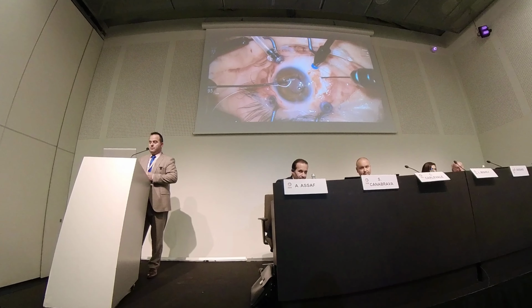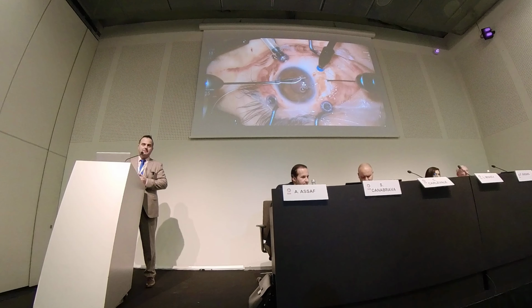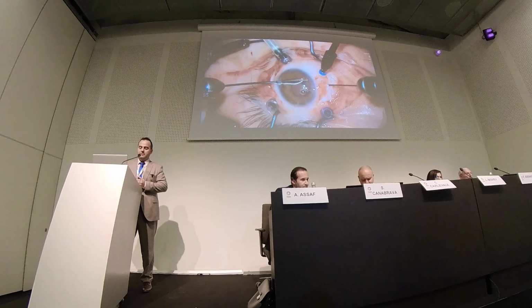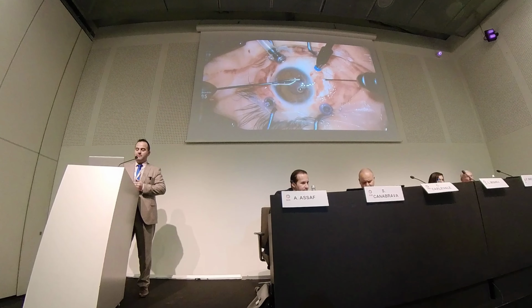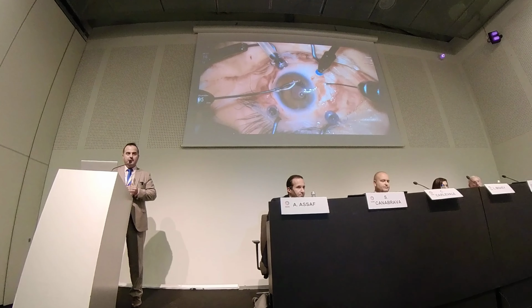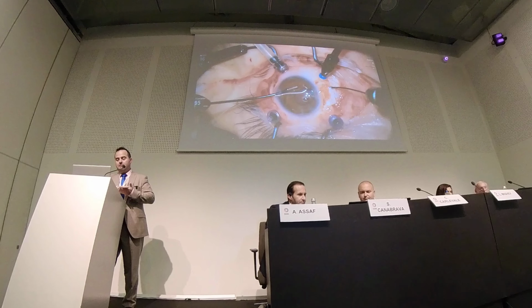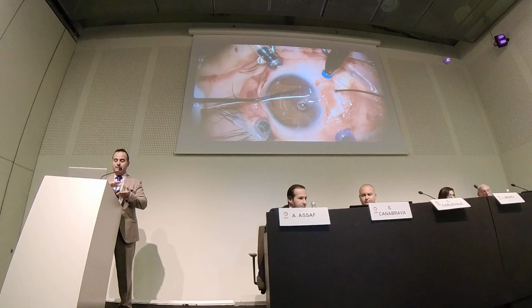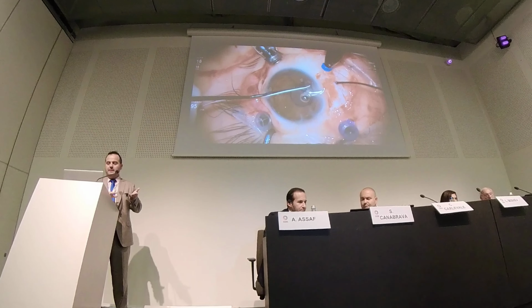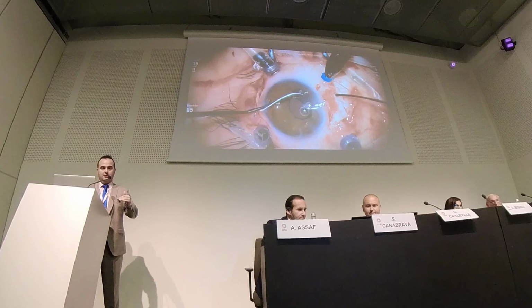So here I'm using a handshake technique, and this is the basic difference between the colleagues who introduced Gore-Tex fixation years ago and my technique. Because I don't open the sclera, I don't pass the sutures outside the eye and then implant the IOL through, let's say, a 5.5 or 6 mm corneal opening or scleral tunnel.